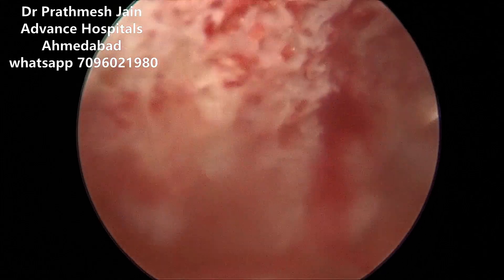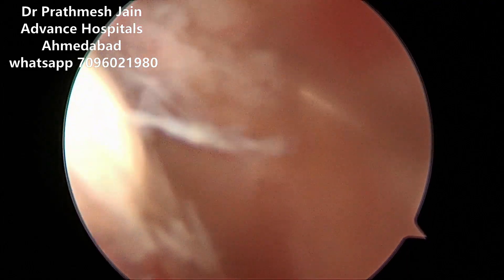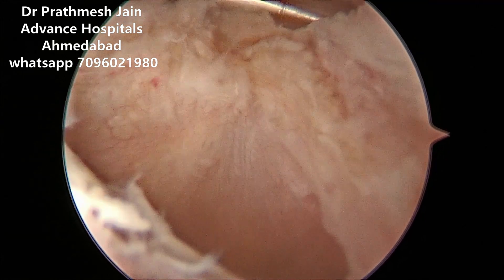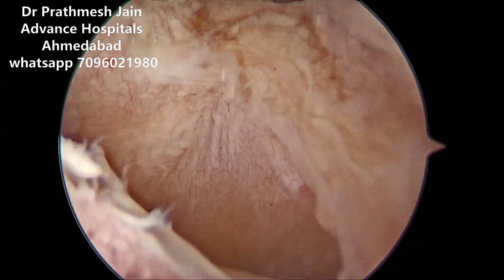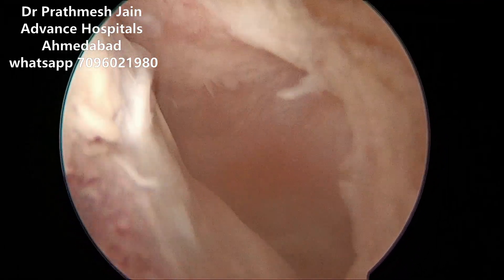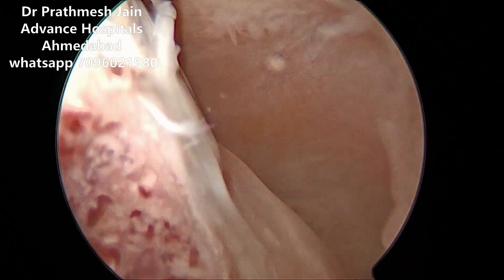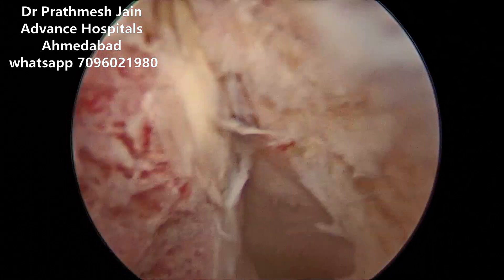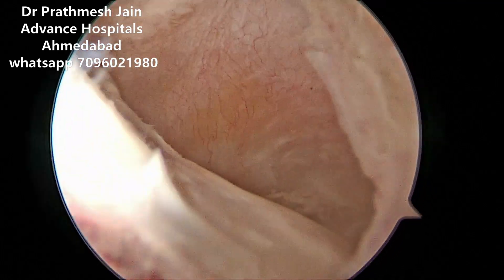You can see here that this is the level of the anterior neck, and we can just elevate the capsule using the shaver blade as a retractor. If there are any loose bodies in the neck region, you can very well go and identify them there. This is the peripheral compartment you are seeing, and this is the region of the zona orbicularis — the circular fibers of the capsule. It is a thick capsule, but if you do a nice resection, you can see all these structures very nicely.